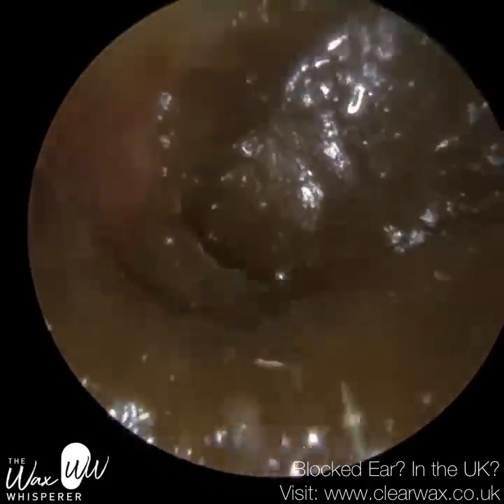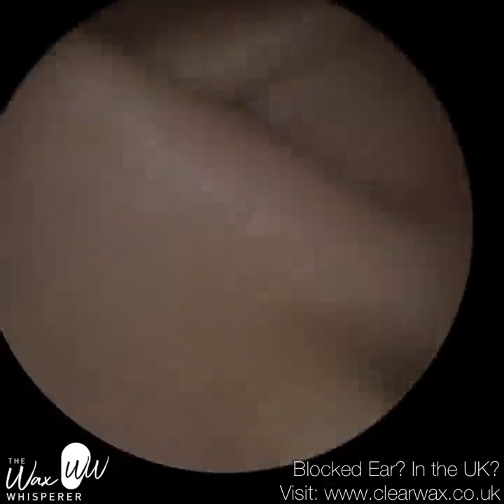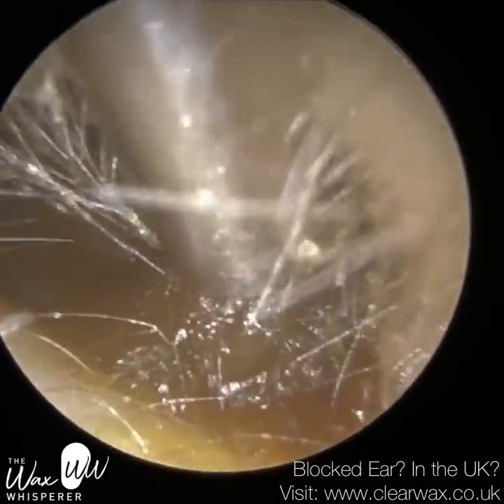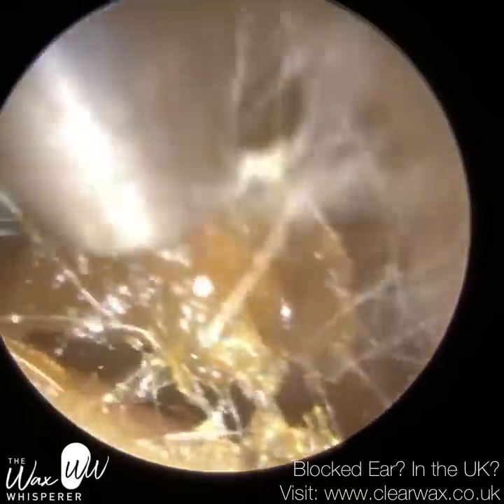And in this particular ear — this is their right ear — the wax had been pushed further in using a cotton bud. You may have seen the indentation. I'm just commencing with their left ear first and performing microsuction. So I'm using a standard Zoellner suction probe.